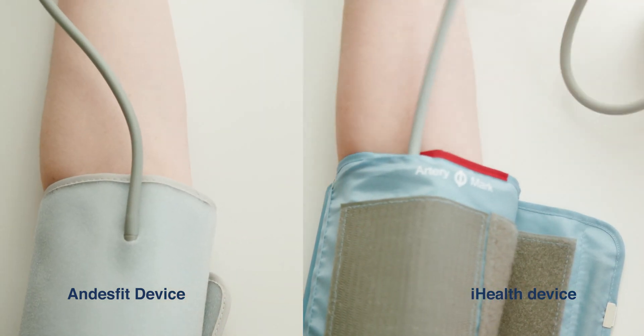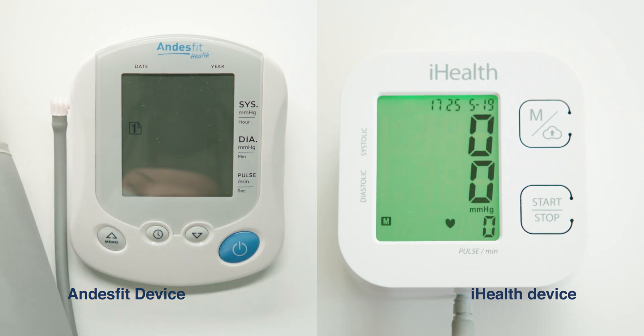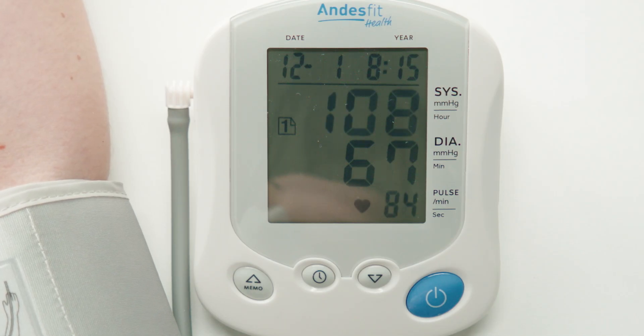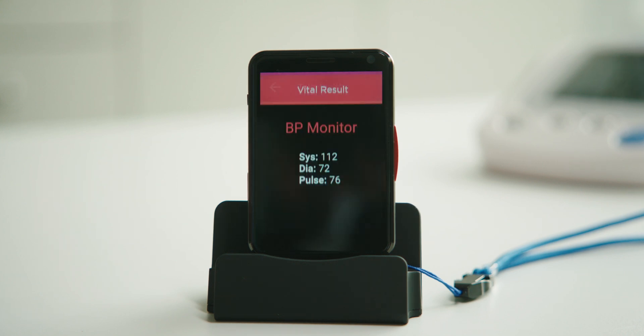Now, rest your arm on the table and press the blue power button on the Andes Fit health device, or the start-stop button if you have the iHealth device. It may take up to two minutes to take your reading. You'll know it's completed once the cuff depressurizes and the device displays the reading. As long as the Link Plus is connected to the dock and plugged into an outlet, your reading will automatically display on the Link Plus device and transmit to your doctor.